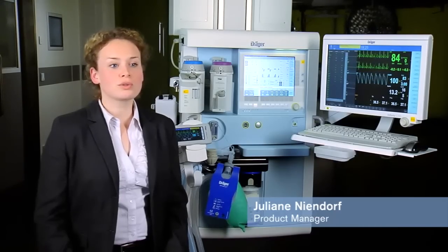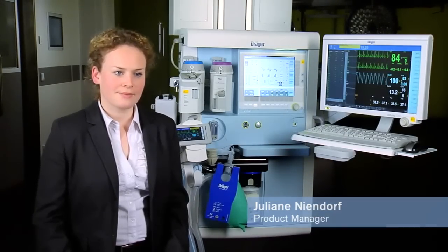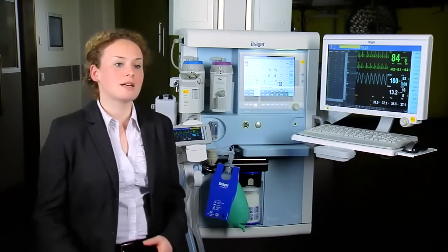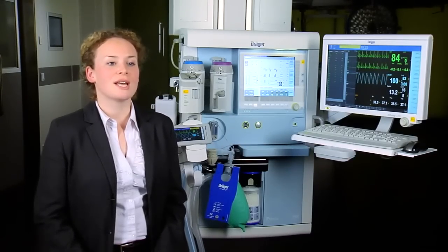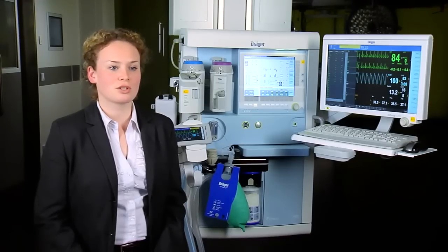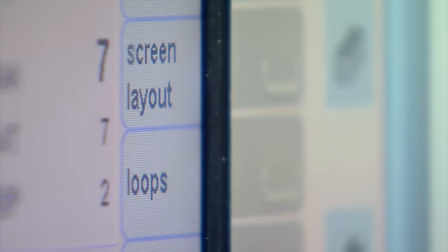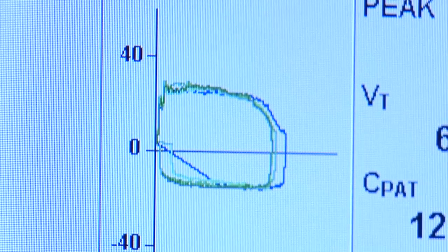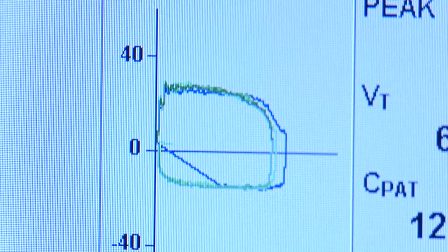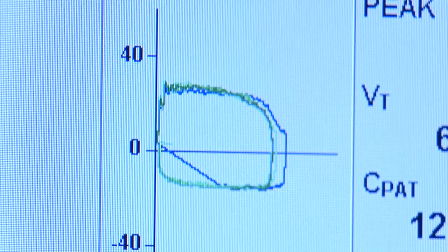For us at DREG, it's very important to support the daily work of anesthesiologists, also with regards to lung recruitment. In the Primus product family, besides the ventilation technology, we offer additional monitoring functions. First of all, there is the loop display where you can see the pressure-volume loop and flow-volume loops, and compare the current ventilation with a reference.